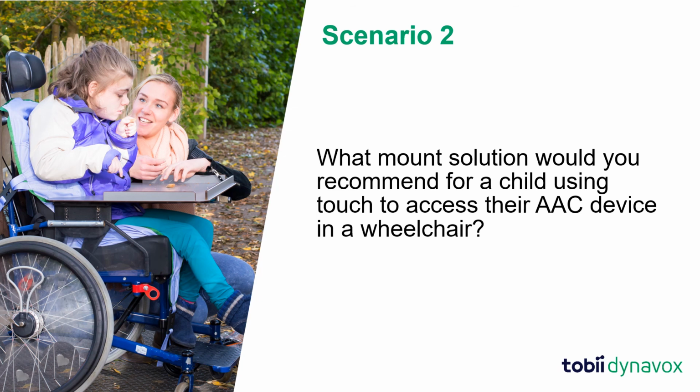Another question might be, what is the size of the device being considered? Mounted touch devices can be either large or small. Therefore, we will find a mount that is suitable to carry the weight of the child's specific AAC device.